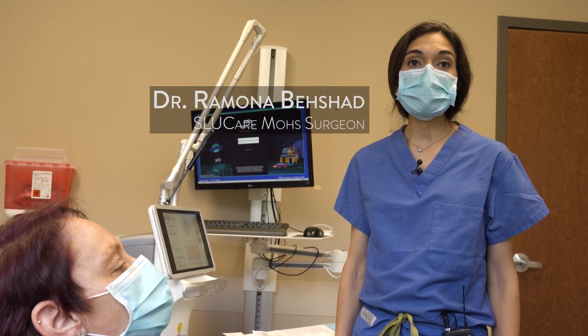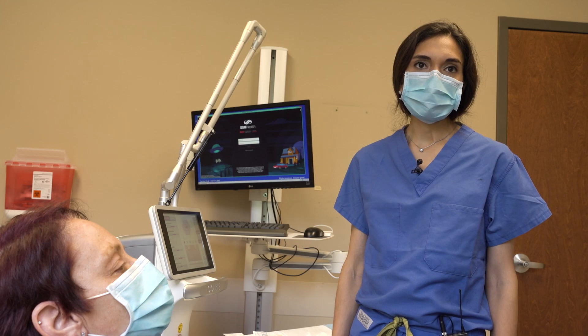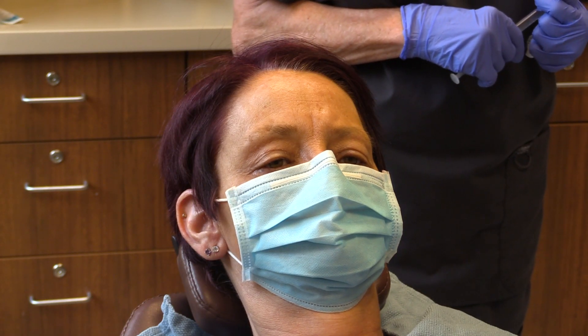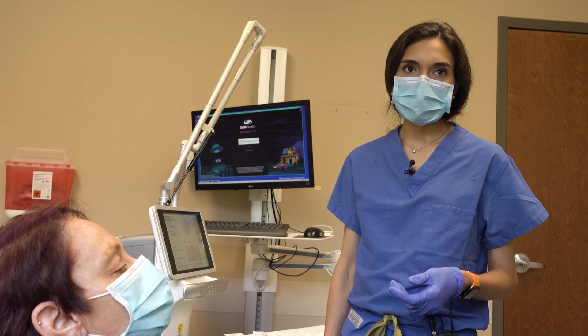The carbon dioxide laser can be used for many things on the skin. One of the things it can do is improve scars. In this case, we have a deep scar from chicken pox, although similar scars can be seen from surgical scars, wrinkles, and acne.